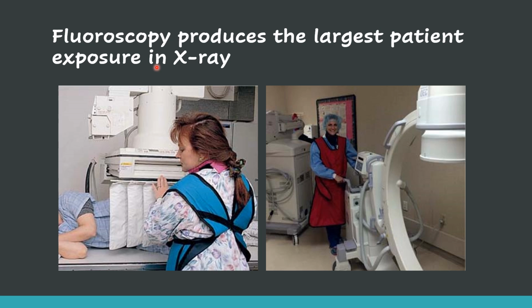Fluoroscopy procedures give the largest patient exposure in X-ray. So regular X-ray, there's not a lot of dose to patients, but fluoro, of course, for upper GIs, small bowel follow-throughs, BEs, a lot of radiation dose for the patient. Same thing with C-arm as well.